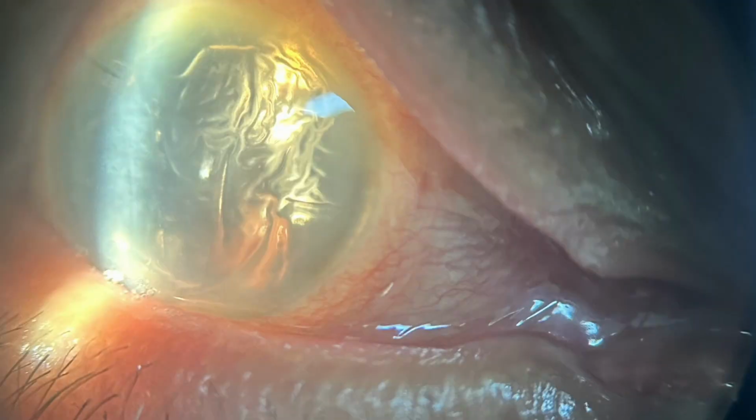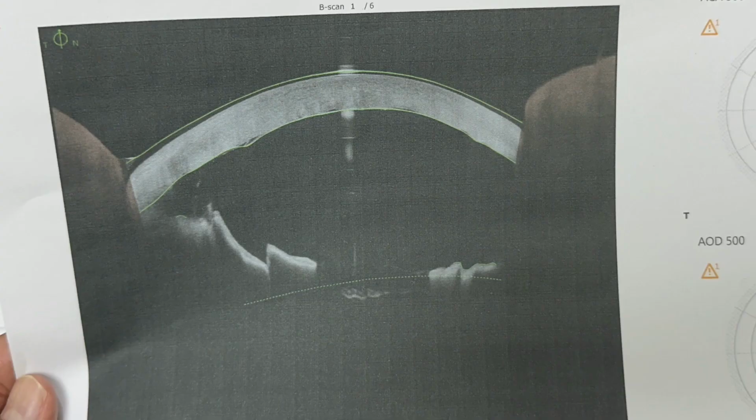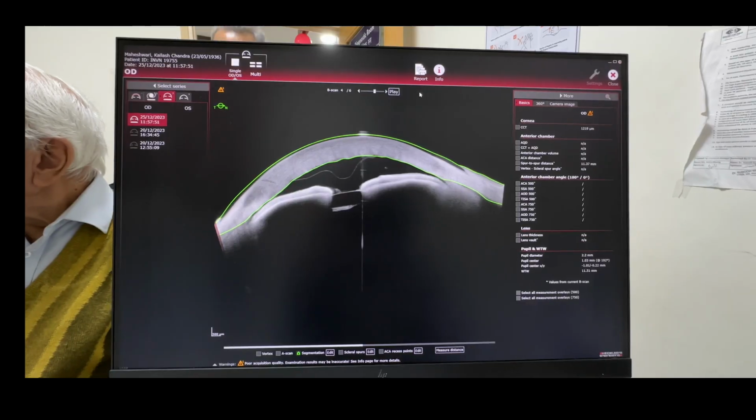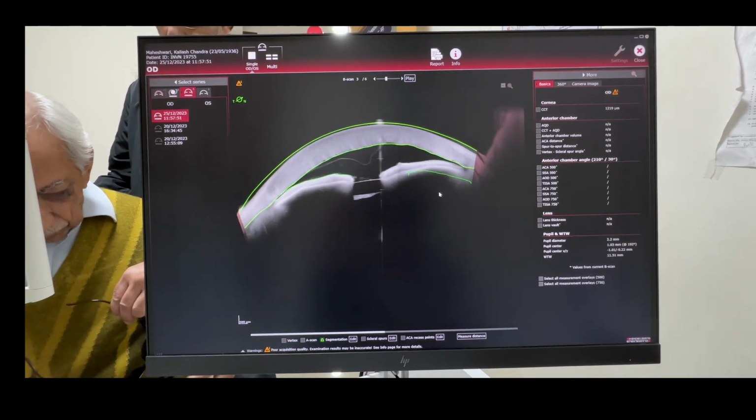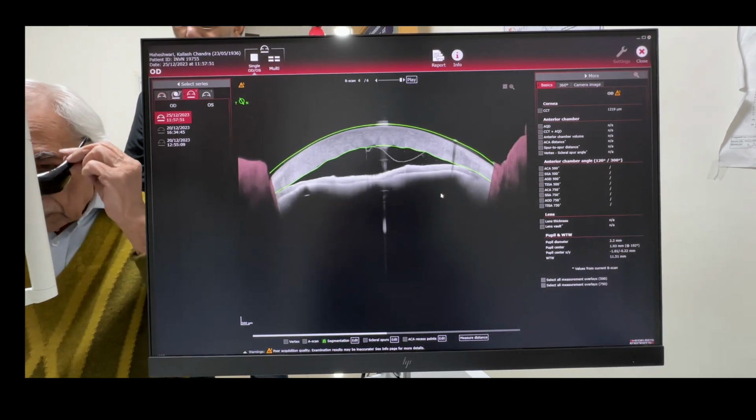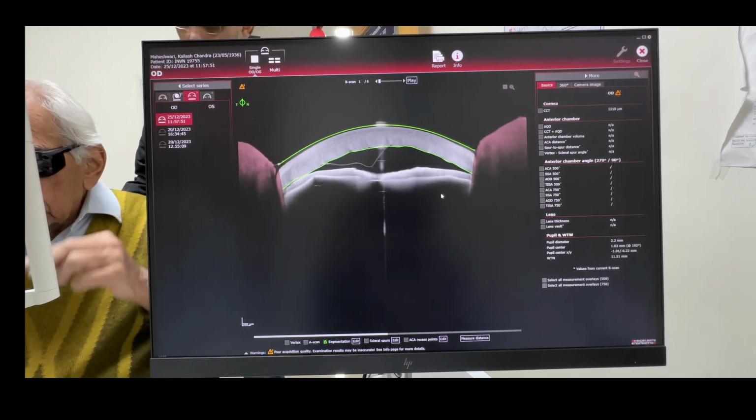Immediate post-op examination on slit lamp shows full chamber air along with some Descemet folds. ASOCT looks good, which shows attached DM. 1 week post-op, the patient complained of severe photophobia and blurring of vision. When the ASOCT was done, it showed detached Descemet membrane.